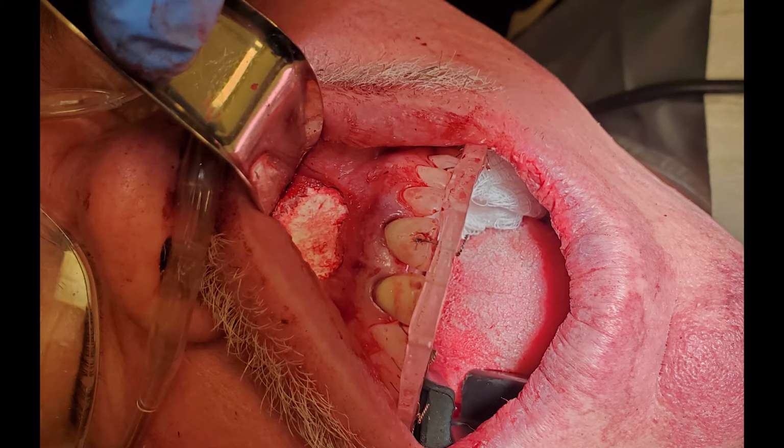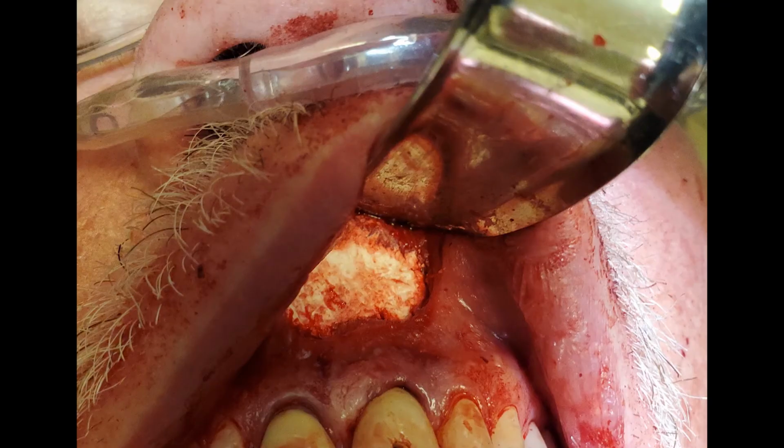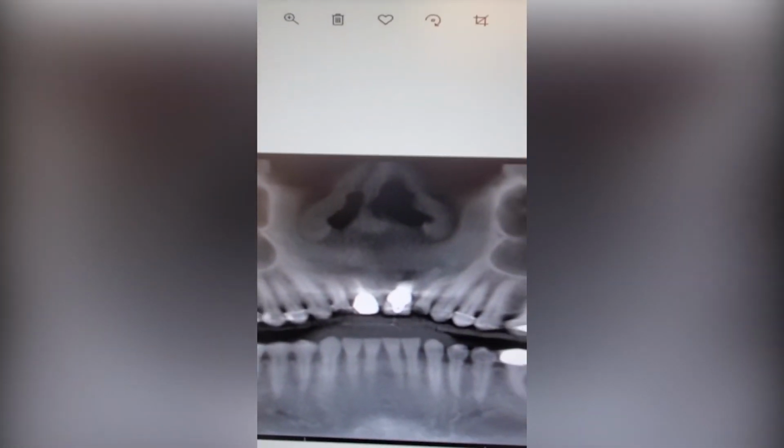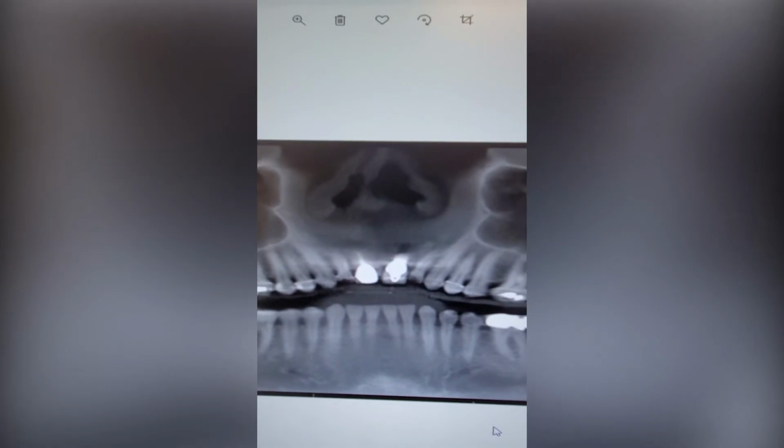All right guys, this is the post-operative video showing the coronal movement of the interproximal bone to a normal position with that implant in number 9 after doing a localized osteotomy, pulling it more coronal. Granted, this is a little off. This X-ray is very accurate, but it's just a scan that doesn't give you a full appreciation because of its current angle. But you can see how that interproximal bone, right here, is up much higher than where it used to be.